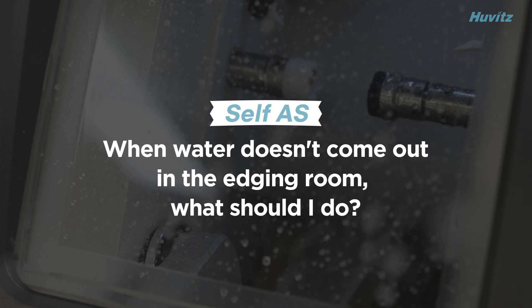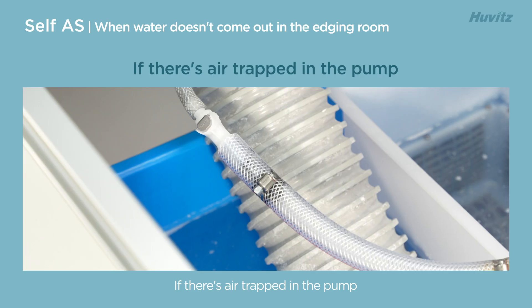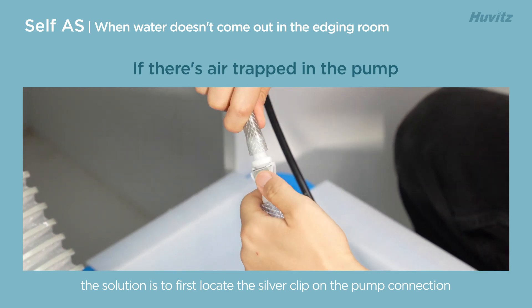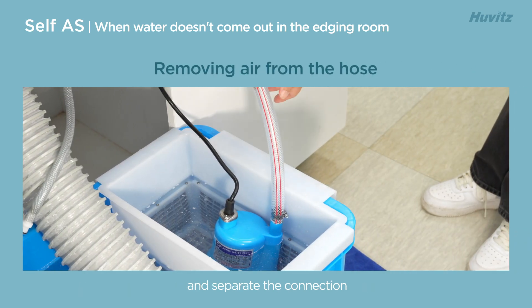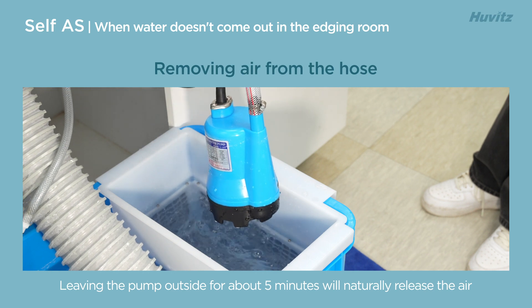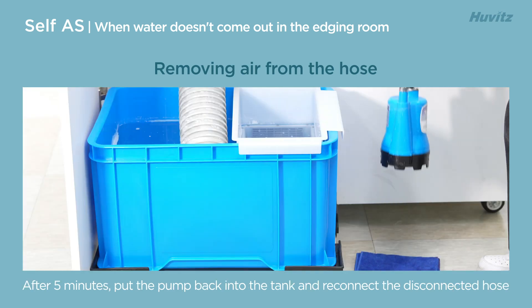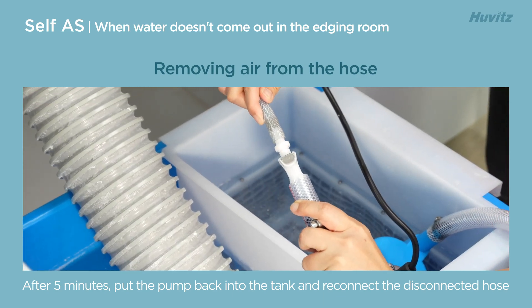When water doesn't come out in the edging room, what should you do? If there's air trapped in the pump, the solution is to first locate the silver clip on the pump connection and separate the connection. Leaving the pump outside for about five minutes will naturally release the air. After five minutes, put the pump back into the tank and reconnect the disconnected hose.